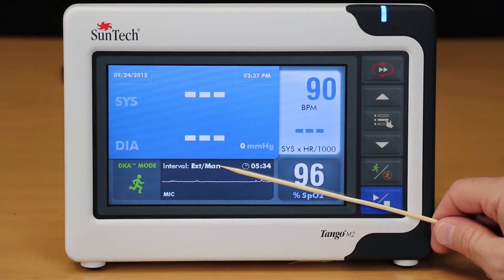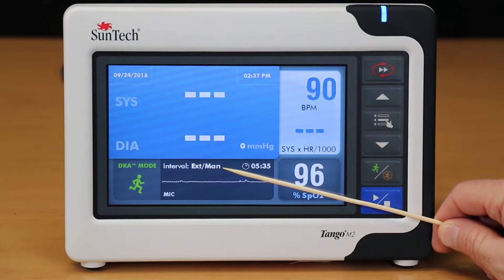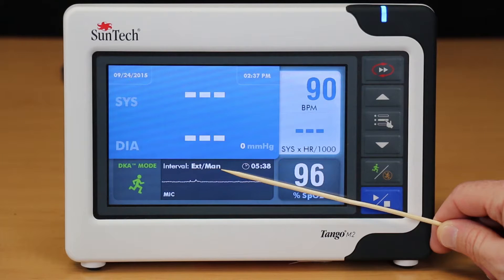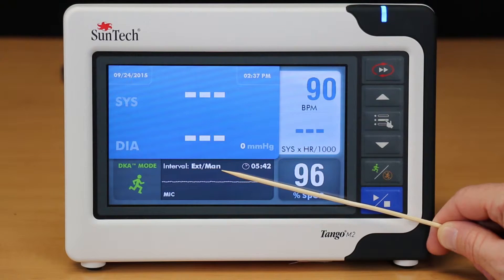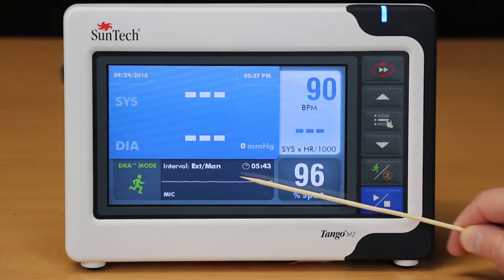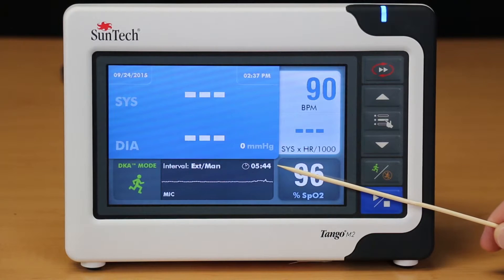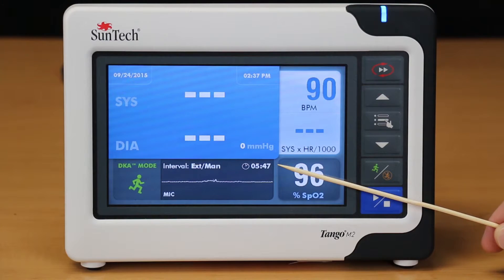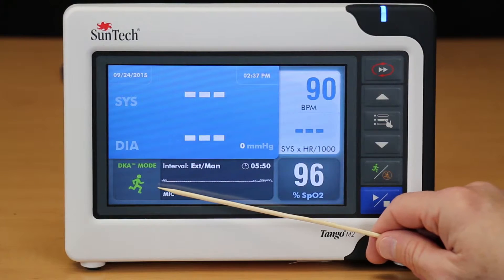At the top corner of this window, the text indicates whether you are acquiring a BP reading signal from a stress system or from the internal ECG board as a programmed interval. To the right of that text is the interval timer, which indicates the time since the last BP result was displayed.